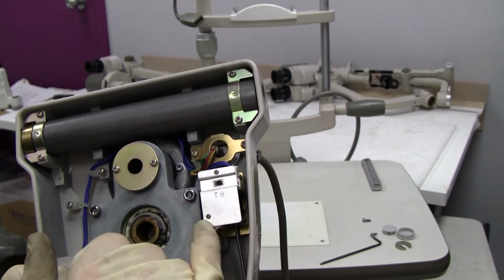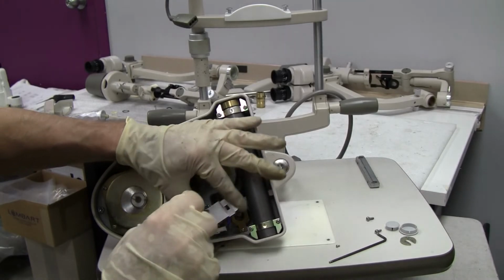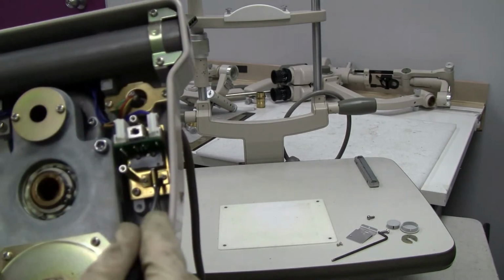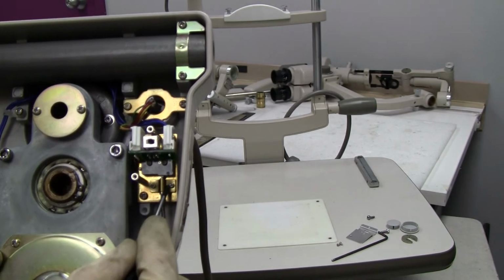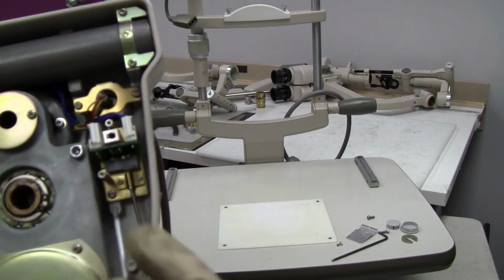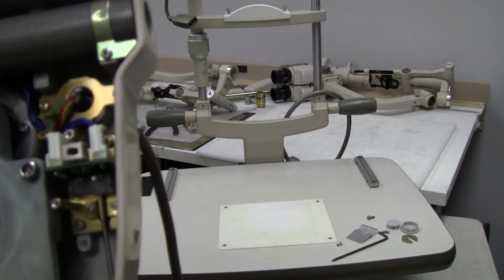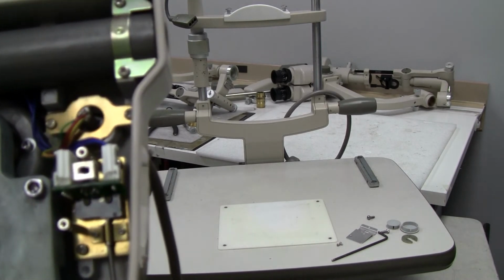So you would take this plate off, these two little Phillips, now going to need to loosen these two screws to pull your actuation cable out of that. See, there's a little switch right there. And pressing the button activates that override switch. Can you see it?